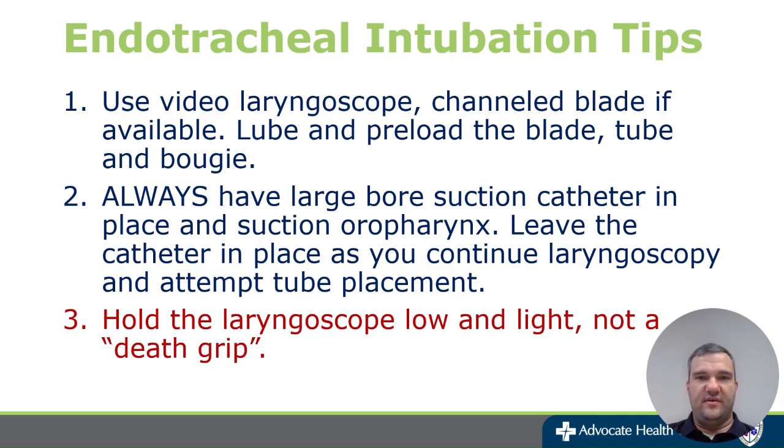And then a light grip on the laryngoscope handle is appropriate as well. Squeezing it really hard, pulling, pushing, things like that. You're not necessarily trying to move the anatomy out of the way. You're trying to work around the anatomy that's existing. So a light and soft grip and kind of following along the anatomy that you see as you're going is going to give you more success than just trying to manhandle the laryngoscope and the ET tube through.